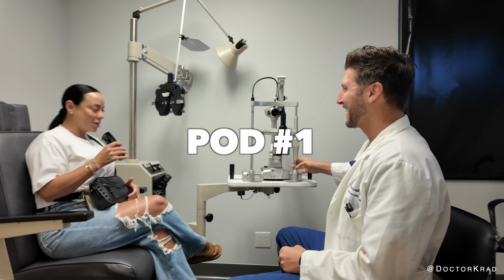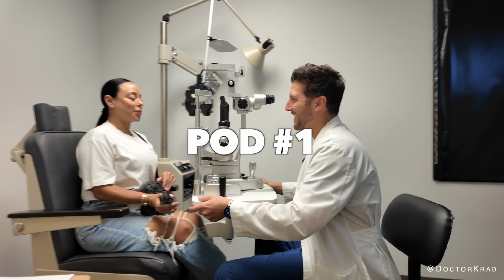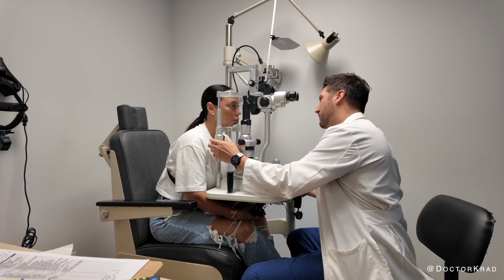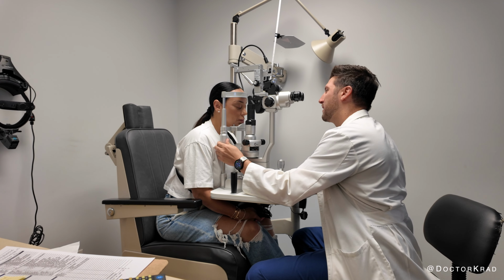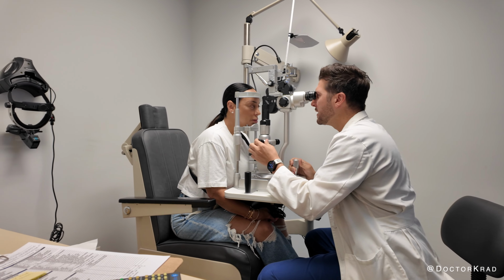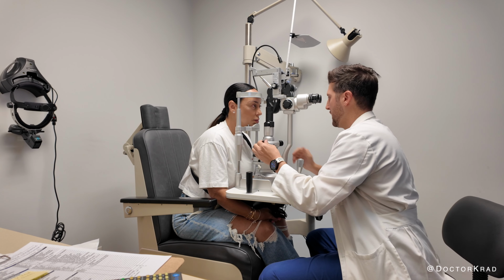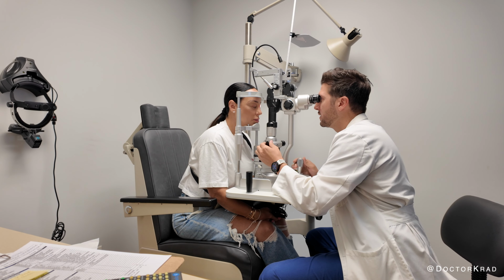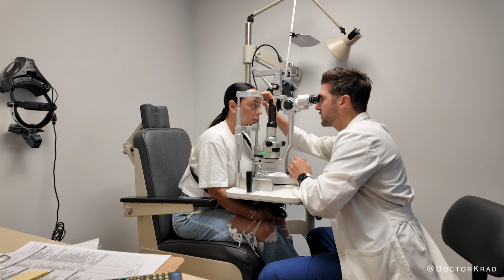All right, so let's take a look at it right here. Okay, rest your chin if you can on that chin rest. Beautiful, and bring your head forward. Awesome, just like that. And just look straight ahead towards me. Beautiful, just like that. Good job. All right, I'm just looking all around.